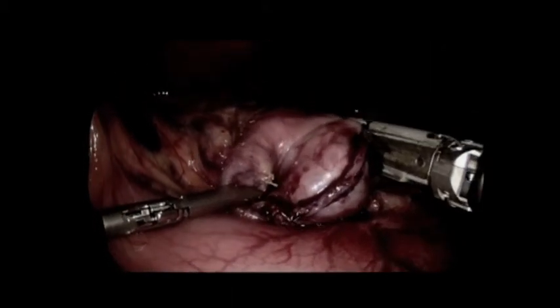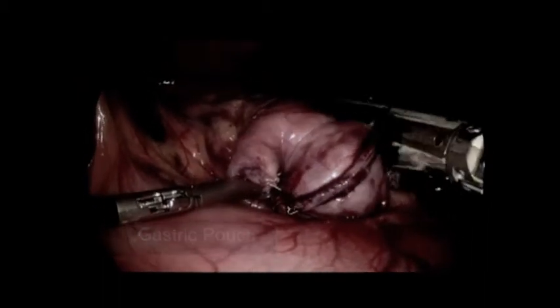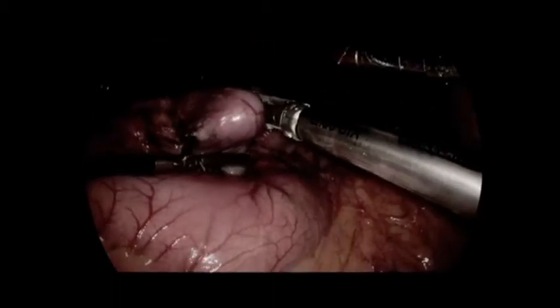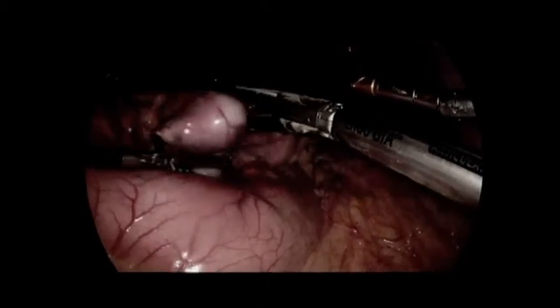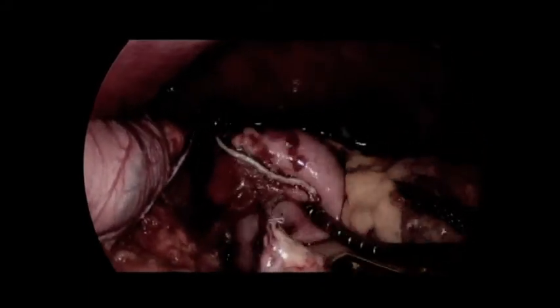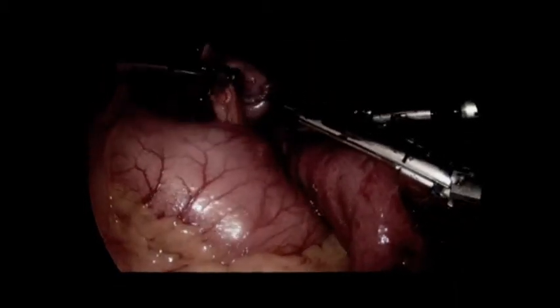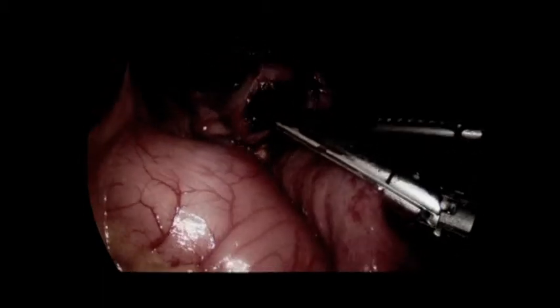We then proceeded with the creation of the gastric pouch. Following this, our gastric bypass procedure was completed with the creation of the gastrojejunostomy in the routine fashion.